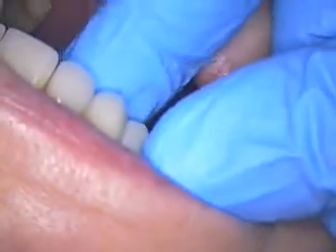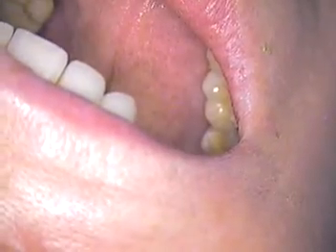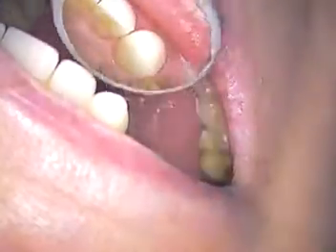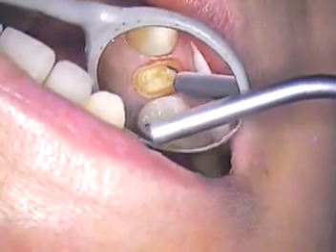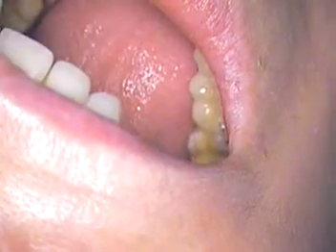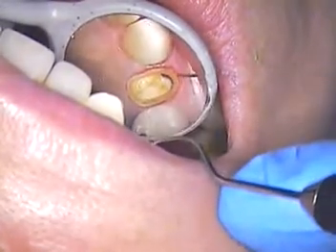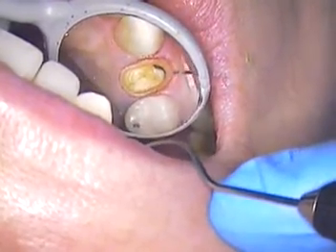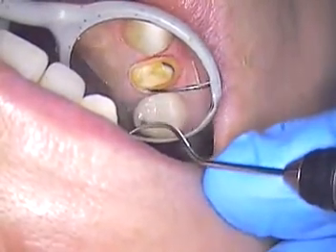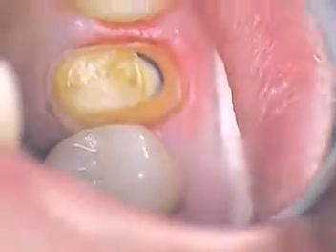We'll just glue this in. We'll use our good cement — it's called Duralon. Let me just show you. We're going to go ahead and mix that material. We're going to leave the cord in until the cement sets and is removed, and then we'll remove the cord. Duralon is a polycarboxylate cement — unlike zinc phosphate, it has some bacteriostatic properties. I rarely see tissue angry when the patient comes back; everything just is perfect.